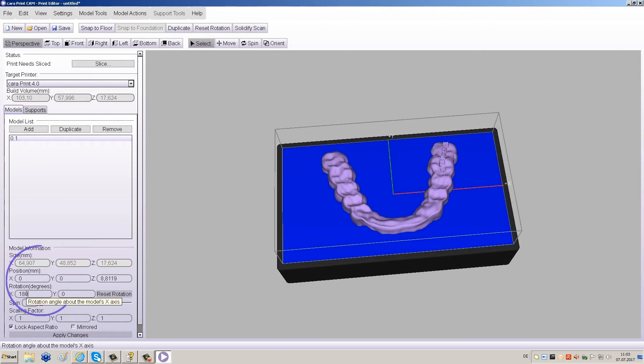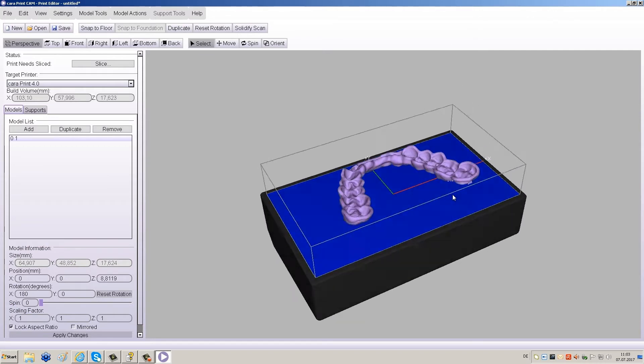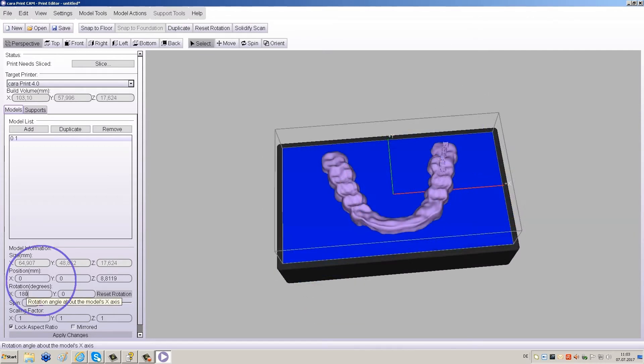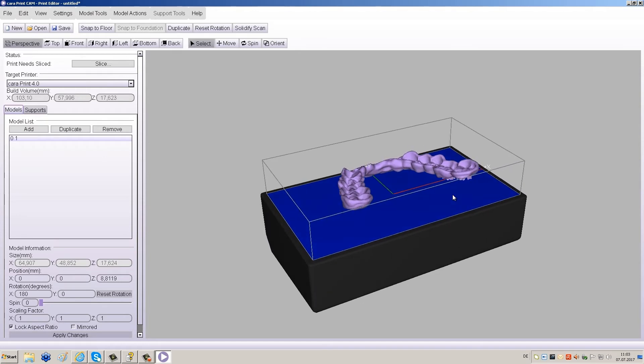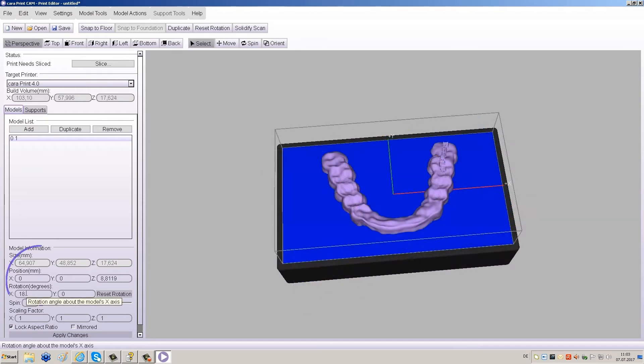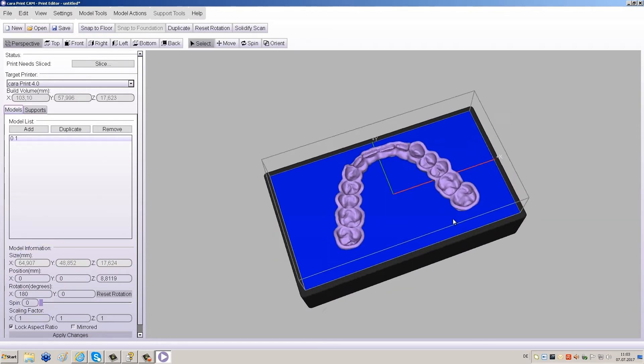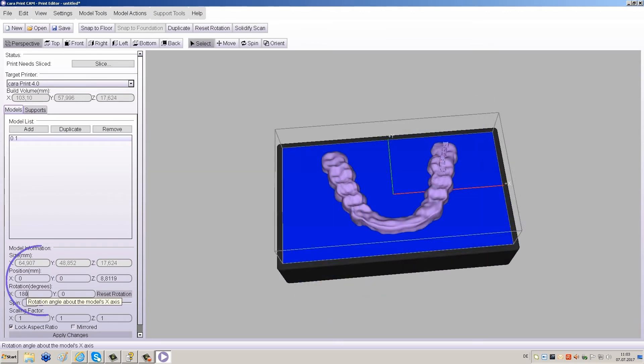You can click and drag anywhere on the building platform to view it from another perspective. To flip the restoration by 180 degrees, click on the entry field for the X-axis under Rotation and enter 180.